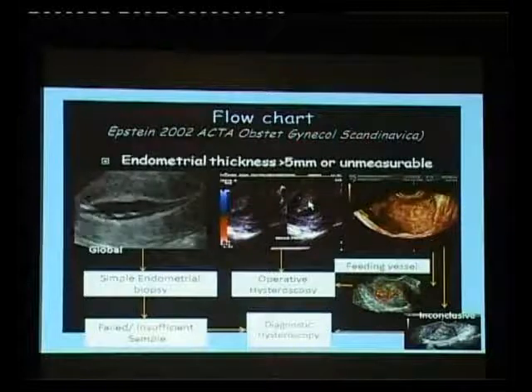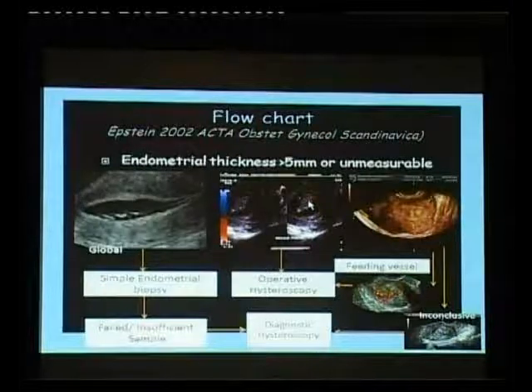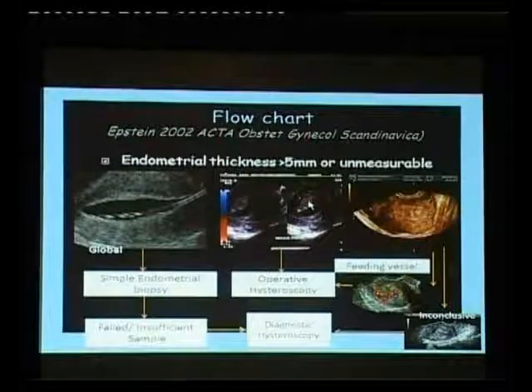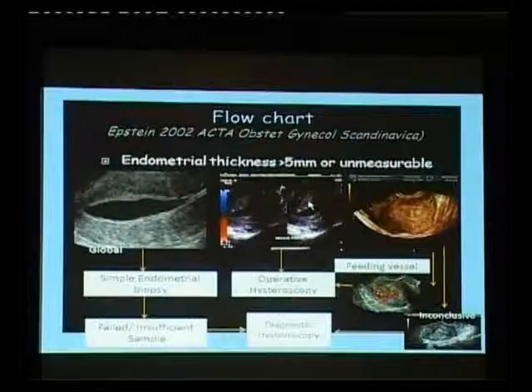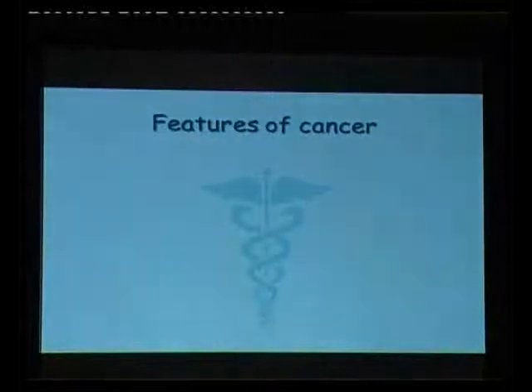So this is how we have to approach a patient with a globally or uniformly enlarged or thickened endometrium, an endometrial thickness of more than 5 millimeters which is focal, or an endometrium which is unmeasurable. So this is how we have to approach these cases.